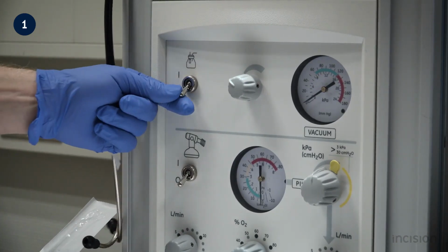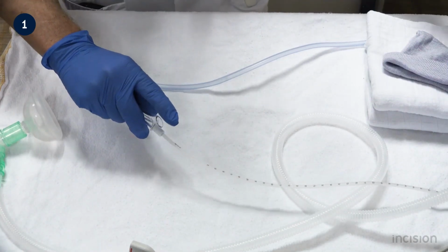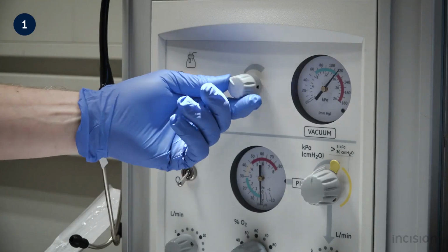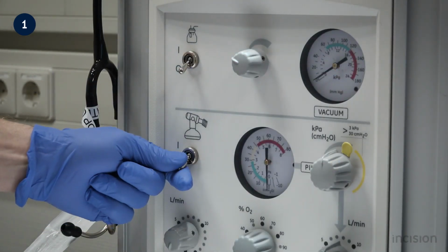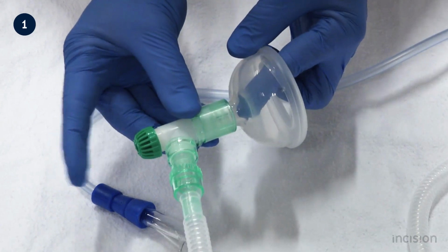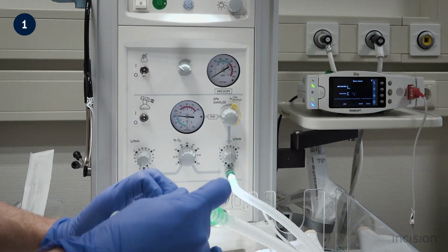Suction can be switched on and off using the control panel, as seen here, and it should first be tested by closing off the suction device. The suction pressure may be adjusted as seen here. The oxygen can be switched on and off using the control panel, as seen here. The positive end expiratory pressure and positive pressure ventilation settings are checked.